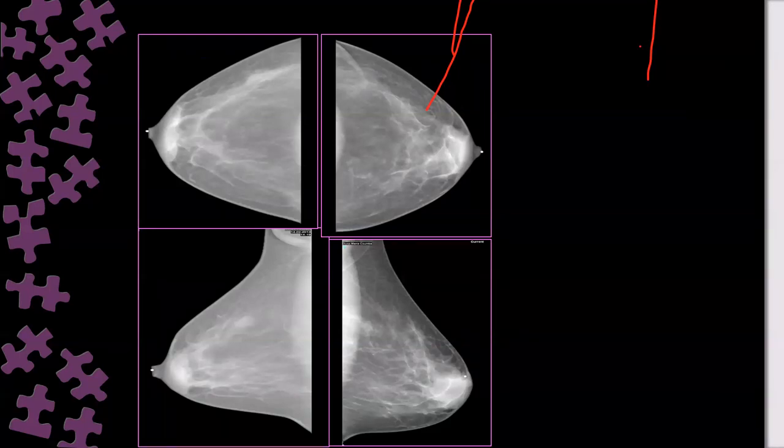Can you check this one? Optimum or not optimum? Quickly. The CCs are optimum. Excellent, well done. The ones above are CCs and are optimum. Why? I can see the nipples bilaterally in profile. I can see both pectoralis muscles, and both nipples are in profile and central, pointing straight forward.